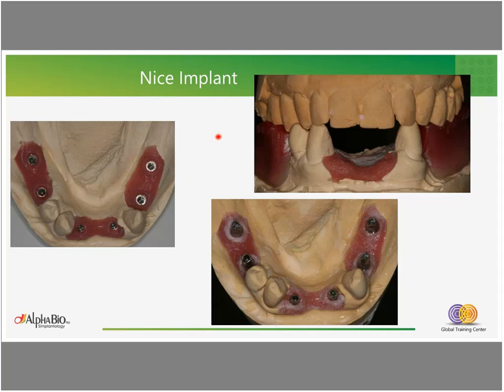In this case, the abutments were selected in the lab, and according to the parallelism and pathway of insertion, the technician will select the abutment, and we will make the preparation of the abutments to have a common pathway of insertion for the posterior area, and for the anteriors, for the bridge that restores the anteriors. So the abutments at the anterior area were slim abutments connected to slim implants, and the posterior implants were standard platform, so the abutments were suitable for the molar and premolar area.